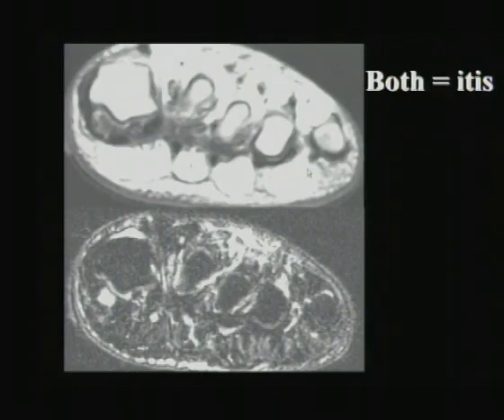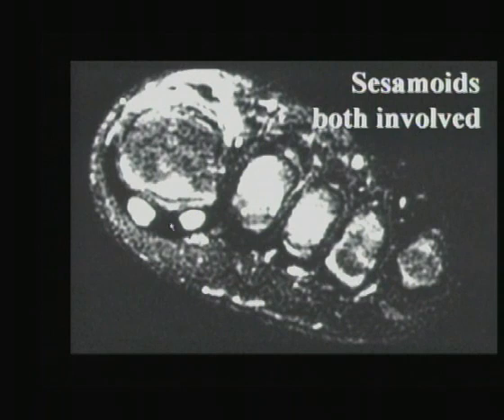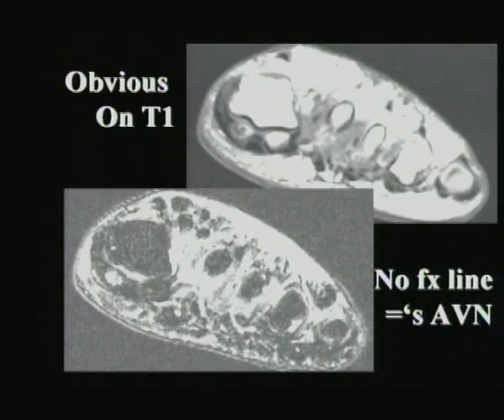I like to reserve sesamoiditis for rare circumstances — both sesamoids must have abnormal signal. Here you can see edema on an inversion recovery sequence as another example. The number of times I've used this diagnosis in the last three years is probably only one or two. Five years ago I would have used it in half of all sesamoid cases I read. It's not that the disease is changing — I was just making more mistakes.